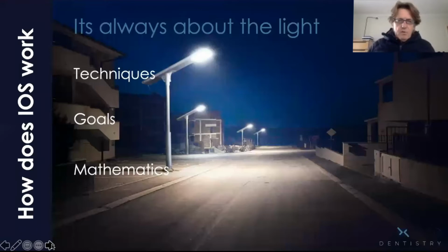All right, so when you scan, how does a scanner work? What's the difference between taking an impression and doing a scan? The first thing, as you can see there, is that it is always about the light. In this case, you're seeing something with almost ambient light. It's light in the distance. It just goes to show that where light doesn't reach, you can't record, in our situation in dentistry.